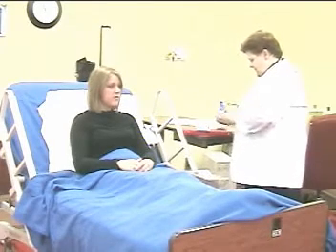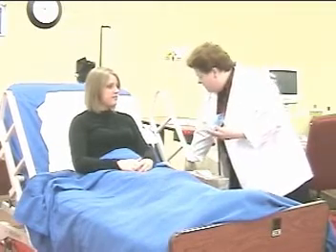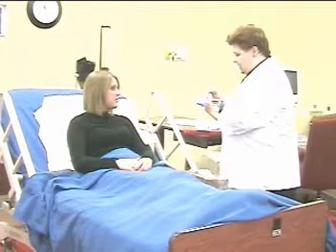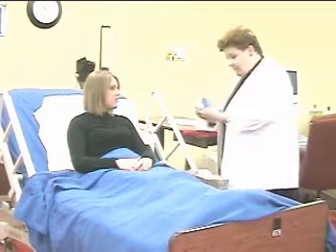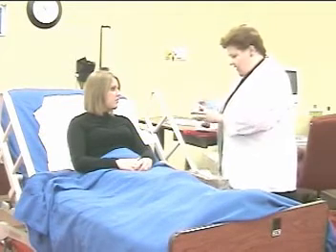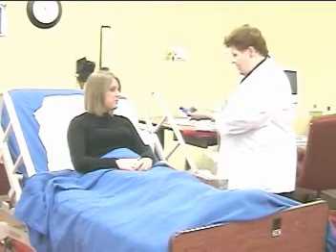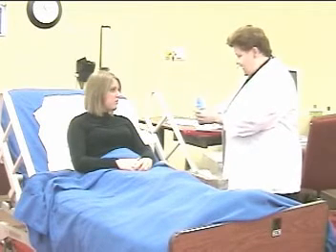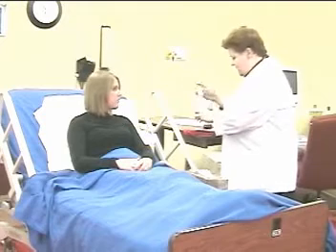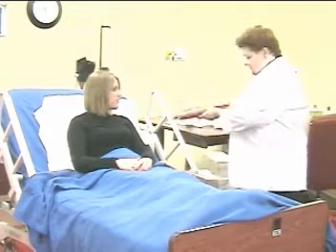Once finished, cleans up after the procedure and makes sure the patient is in a safe, comfortable position. Are you comfortable, or would you like me to put your head down? Before I leave, I want to tell you a little bit about how to take care of this. Keep inhalers out of the reach of small children. Take the cartridge out and wash the boot in warm soapy water, rinse it, and let it air dry. Keep the cap on when not in use to keep debris out. Do the same with the aerochamber — wash in soapy water, rinse, and air dry every night. The doctor ordered two puffs every four hours. I'll leave the medication and spacer at your bedside along with your Kleenex. Then records the procedure in the patient's chart.